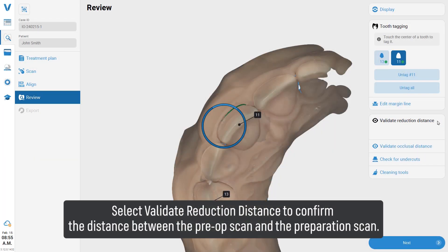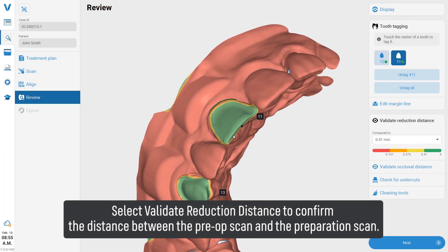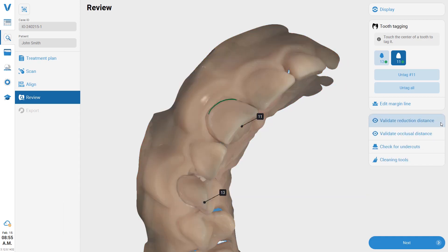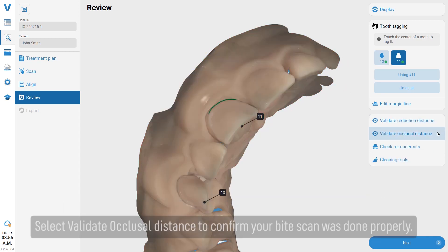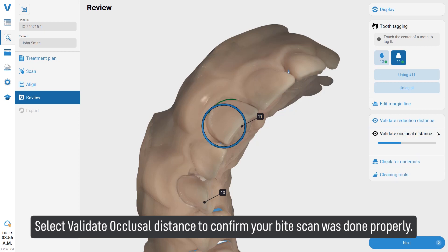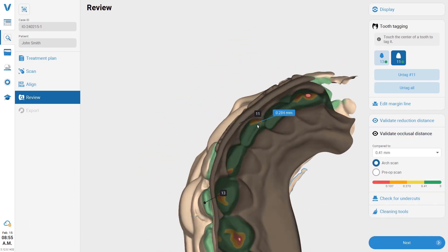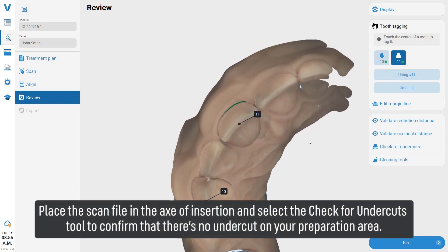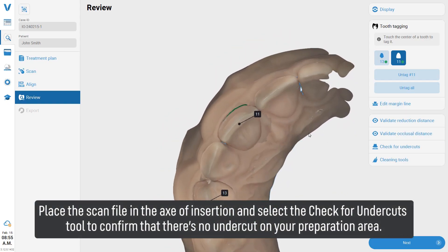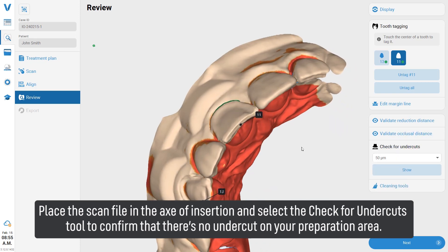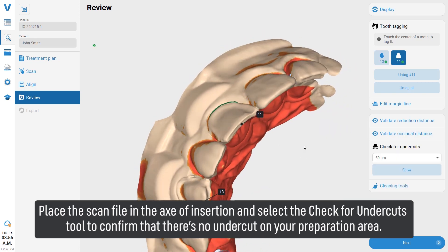Select validate reduction distance to confirm the distance between the pre-op scan and the preparation scan. Select validate occlusal distance to confirm your bite scan was done properly.